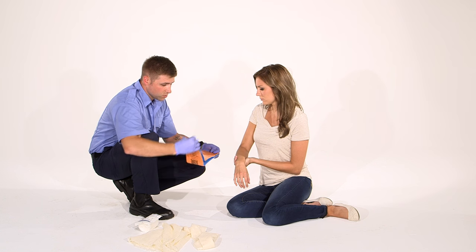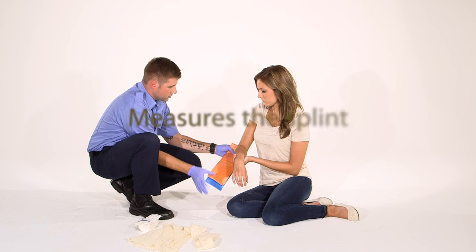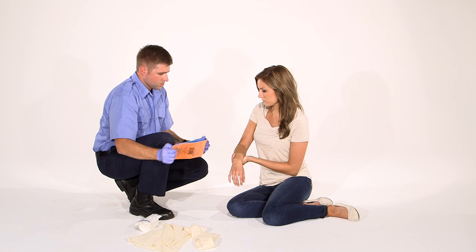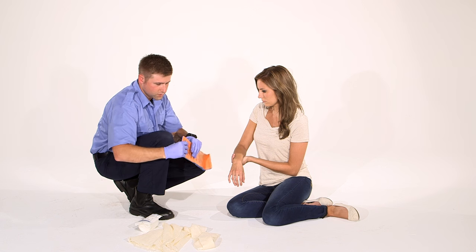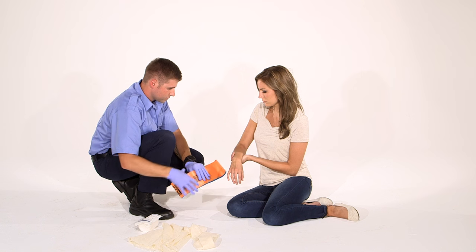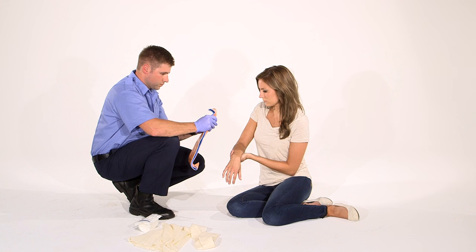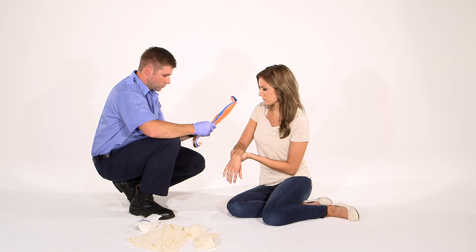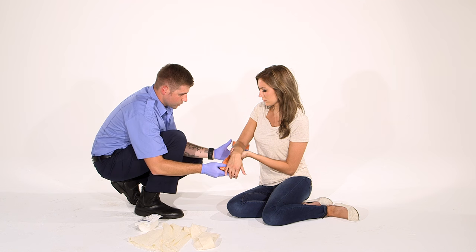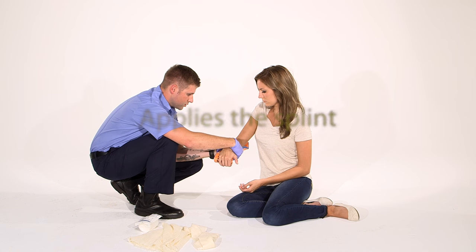I'm going to get my splint out and I'm going to measure it to make sure that's the right size for you. I want it to wrap over the back of your elbow. Curl down so you have something to hold on to. I'm going to hold right here and switch it. I'll make sure that's nice.